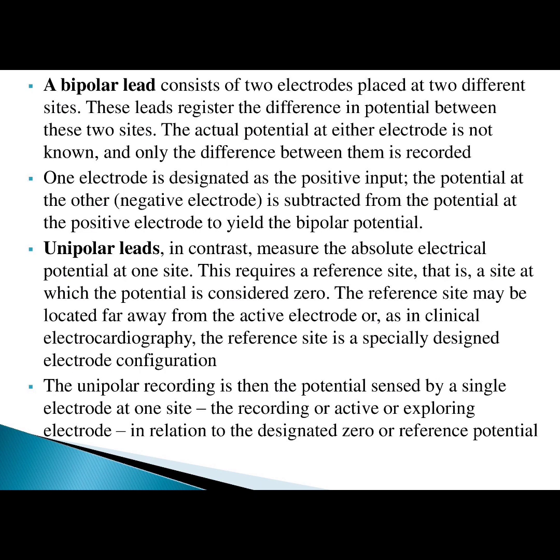The unipolar recording is then the potential sensed by a single electrode at one site, the recording, active or exploring electrode, in relation to the designated zero.